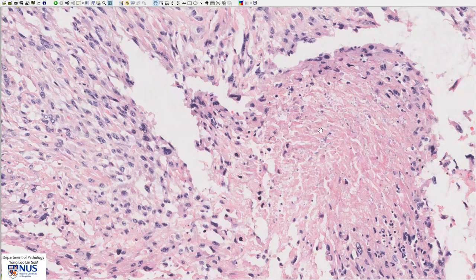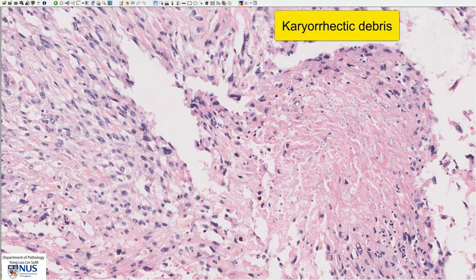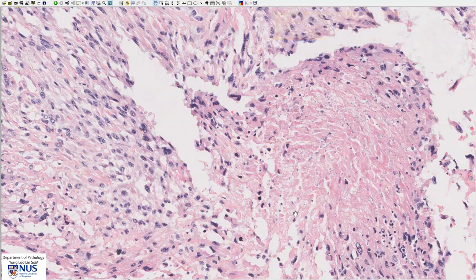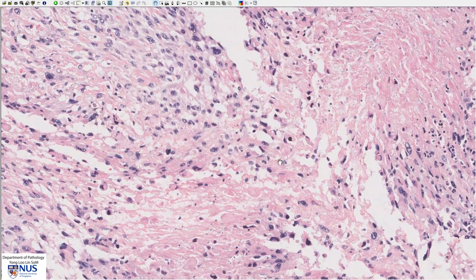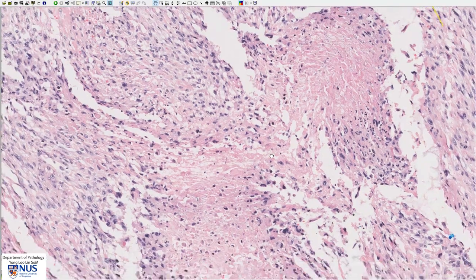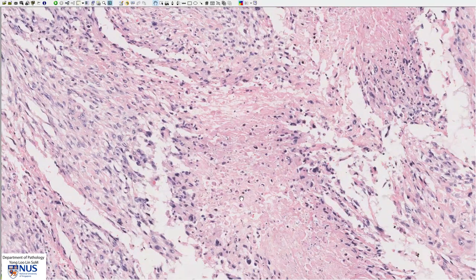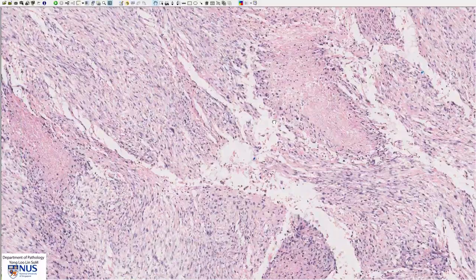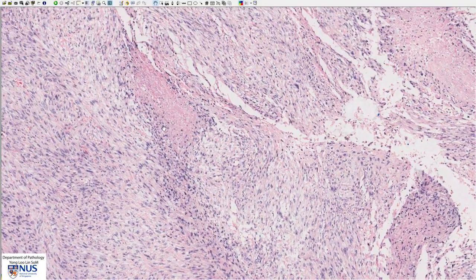Within this area of necrosis, more at the periphery, we can see some little blackish dots. These are the remnant dead nuclei that have fragmented and this is known as karyorrhectic debris. So we have areas of coagulative necrosis, and as we move around we can appreciate more and more of this.